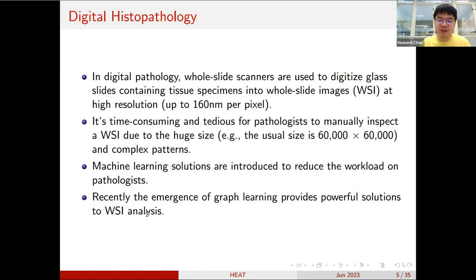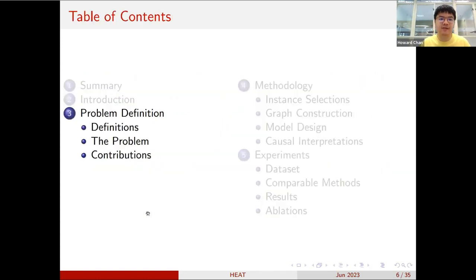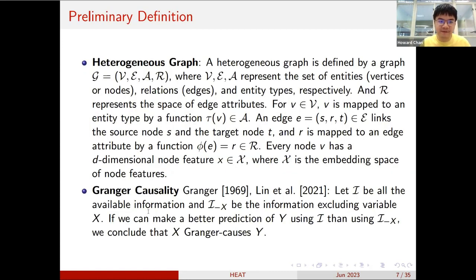So machine learning solutions are introduced to reduce the workload on pathologists. Traditionally, there are multiple instance learning methods. But recently the emergence of graph learning also provides powerful solutions to WSI analysis, which is our focus. So let's go through some simple definitions.